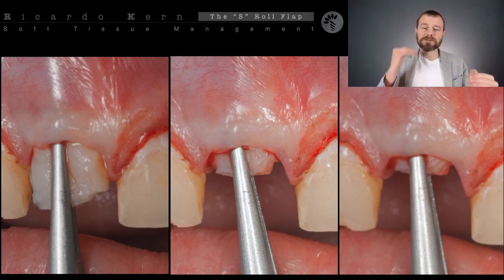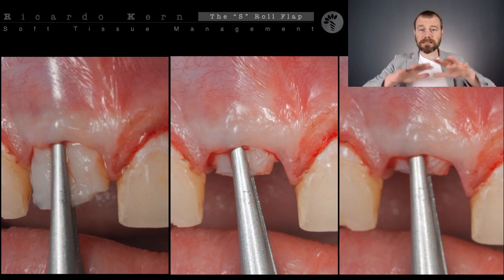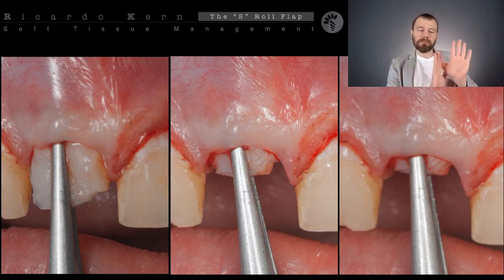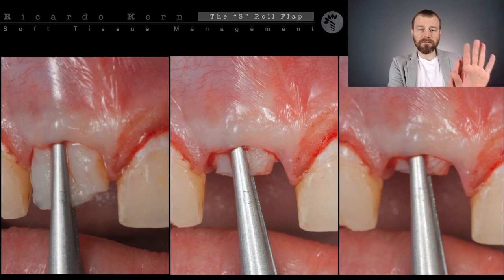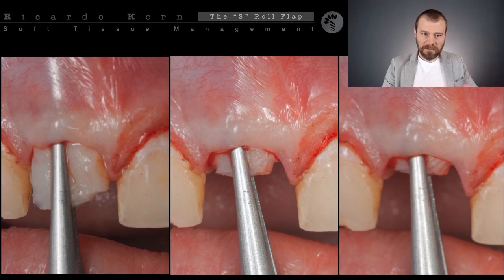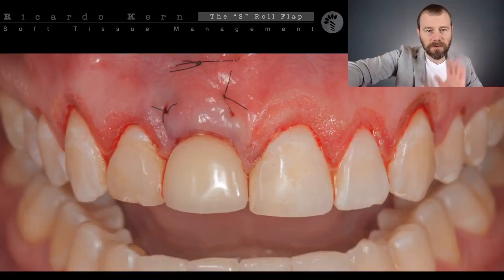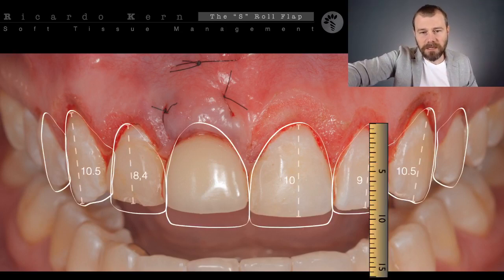If you have the chance to try in the connective tissue in place, do that. Okay, the site is nice, well prepared. My graft is stable alone, with passive fit in this place. Now I can take it out again and start to do that with the sutures, okay? We're going to talk about the sutures tomorrow.